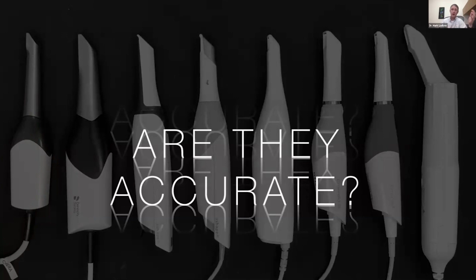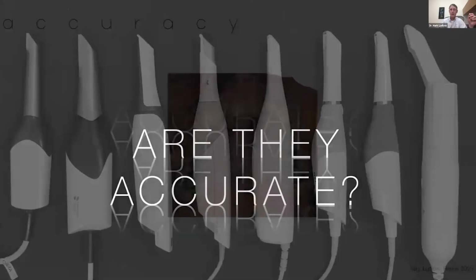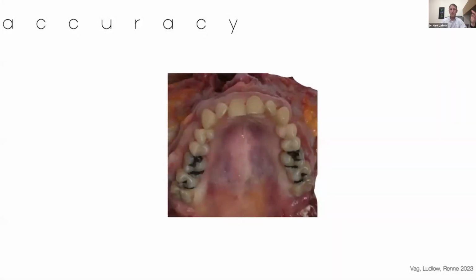And honestly, we first started studying this in about 2012. It's been a number of years where we've looked at accuracy getting better and better and better. What I want to show you is one of our latest papers on this. What we found years ago was a great study design. How we used to always do these things is we'd have these souped up typodonts made out of specific types of PMMA that fluoresce like enamel. We'd scan those with all the different scanners and get a rough accuracy rate. And that's what we'd say, it's X number of microns accurate.